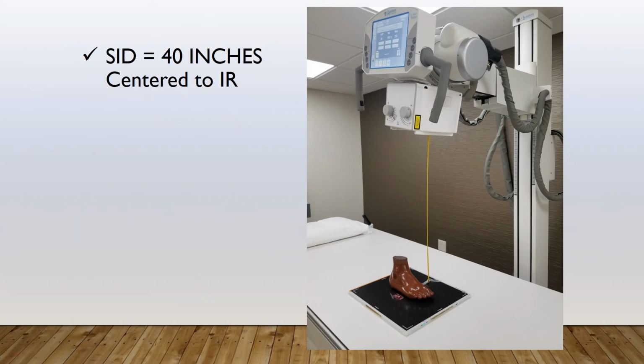Now once I've checked my script and my requisition, I go into my radiographic room and set up for my patient. The very first thing I do is determine if I'm going to be taking an x-ray at 40 inches or 72. Extremities are all performed at 40 inches, so I'm going to set my x-ray tube to 40 inches.